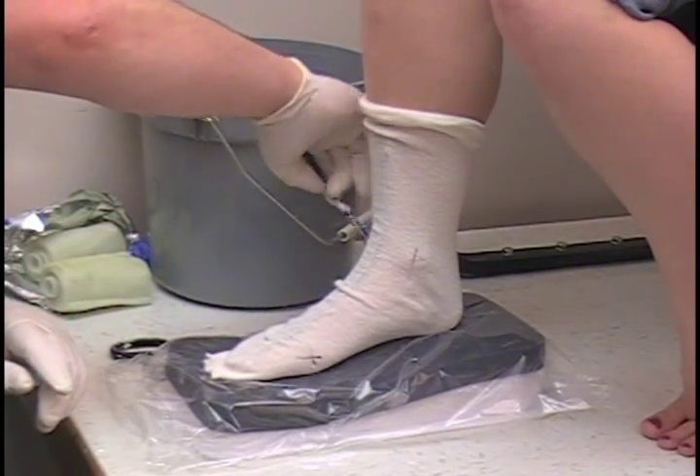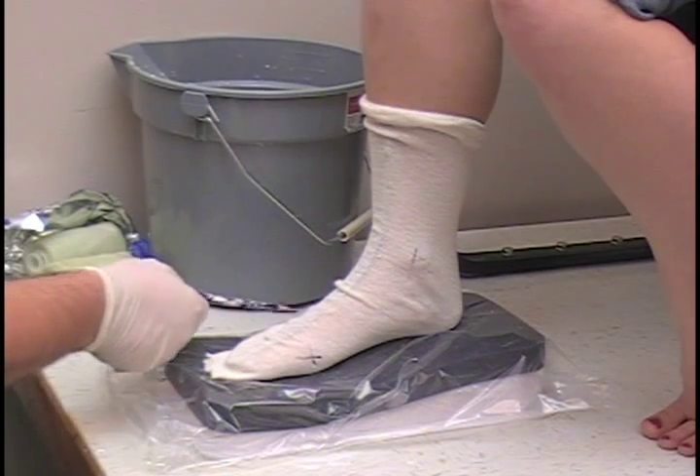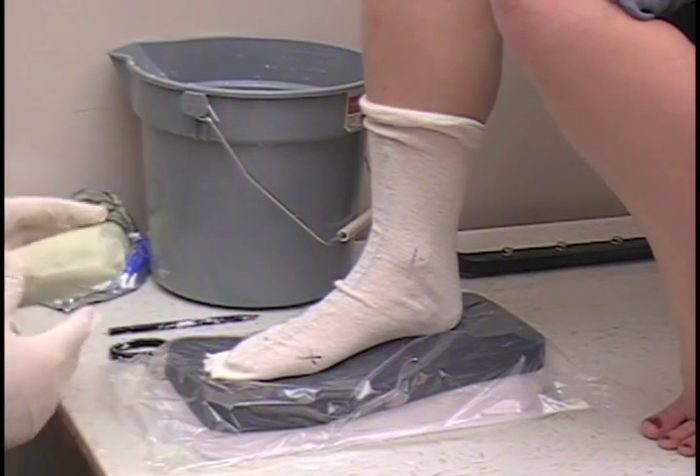For this, I'm going to mark medial and lateral malleolus, and first and fifth metatarsal head. All right, from there it's pretty simple.